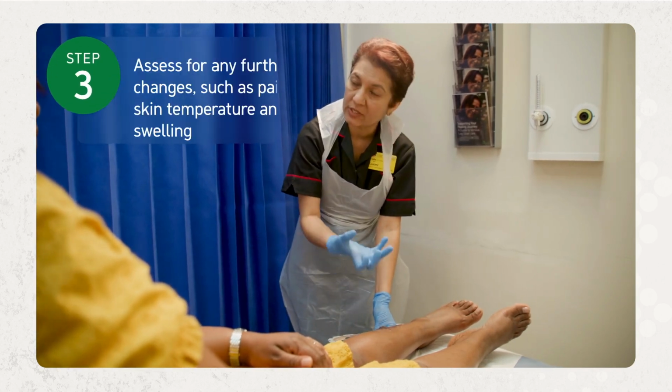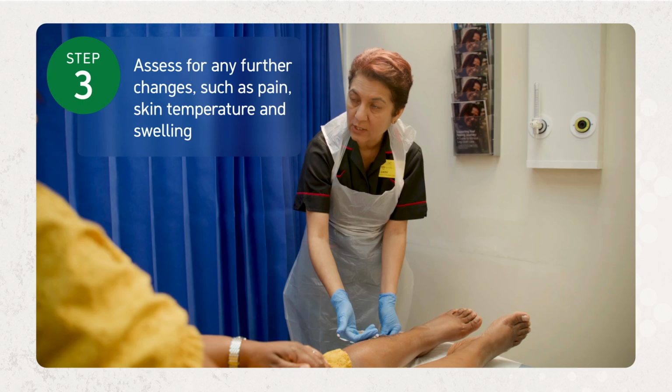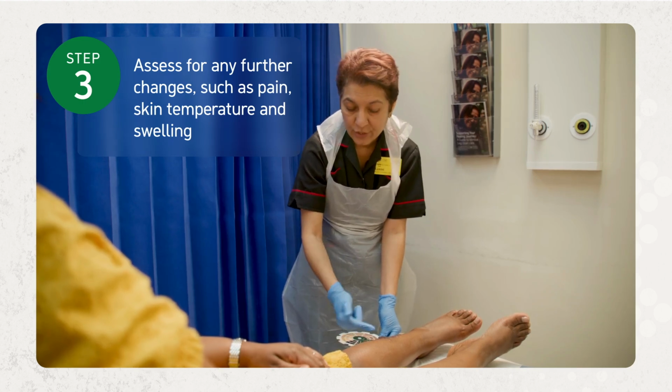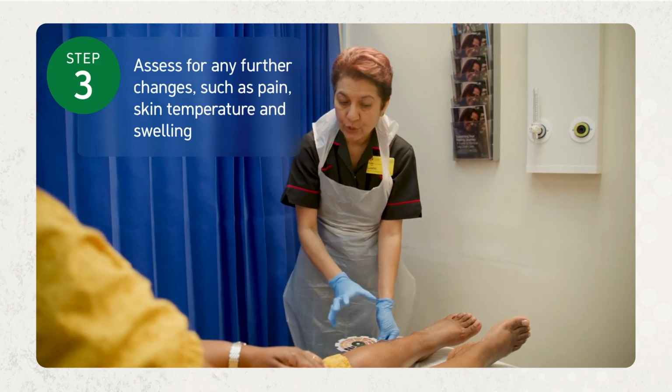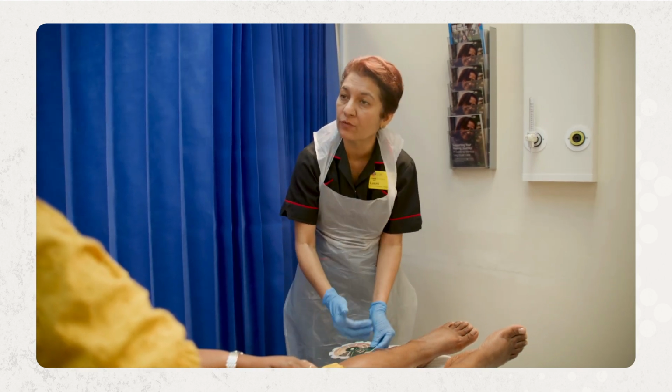And you said it was very painful. So where I touch it, it's quite hot to touch, and you can see the swelling is there. So this is a good way for us to establish whether you've got an infection.